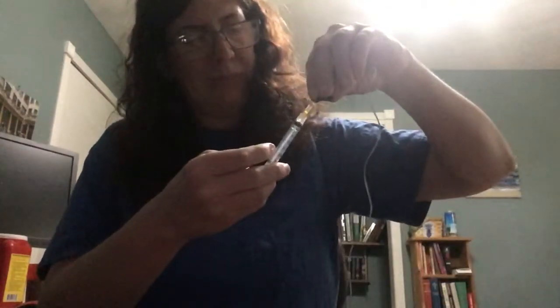I still have probably 1 milliliter of insulin left in this thing, and I don't like to waste insulin. I do like to put a little bit extra in there, because you never know how your blood sugars are going to run on a given day. So, I'm just going to pull that out. Yes, it does have a lot of air bubbles in it.